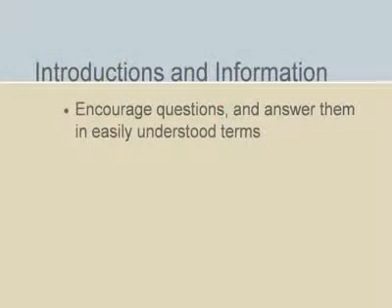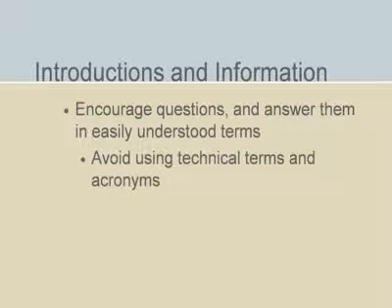Next, briefly explain the test that you are about to perform to the patient and any family members who may be present. Also, encourage the patient to ask any questions he or she may have about the test and answer those questions in simple words and phrases, avoiding the use of technical terms and acronyms.